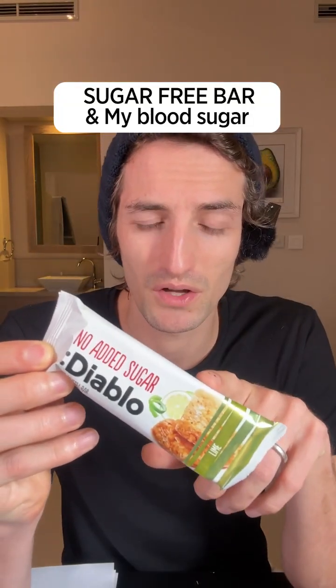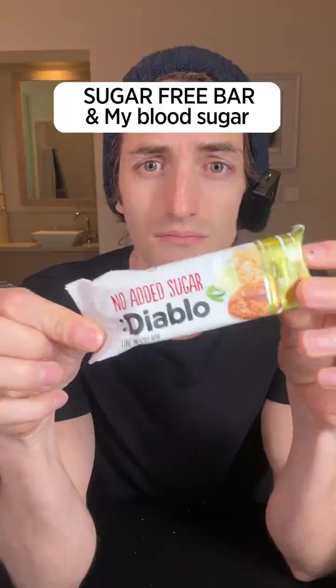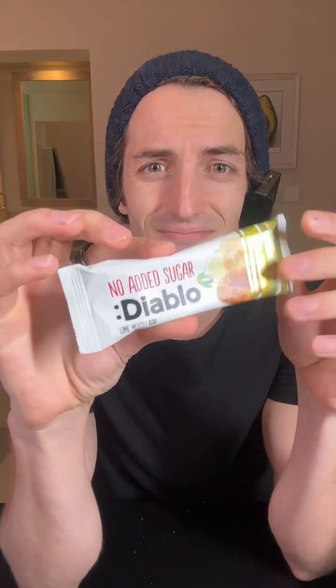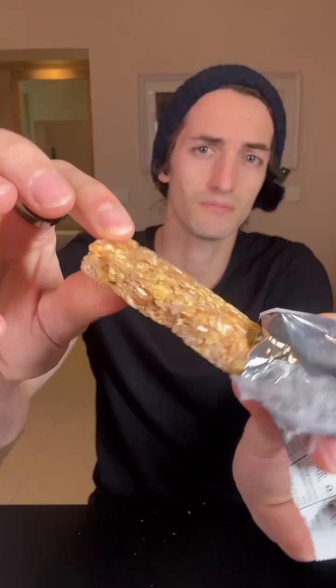Today I'm going to test what a no added sugar snack bar does to my blood sugar. Many people say these bars are very healthy and good to eat all the time because there is no added sugar — only very good things in it. But I also see many people who say this is hidden carbs, hidden sugar, hidden evil things that are not very good for health.